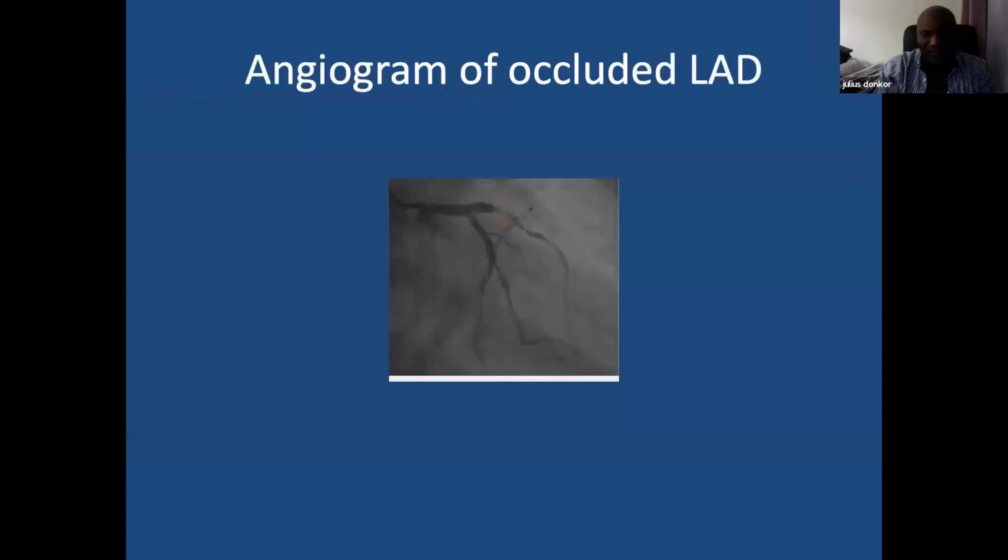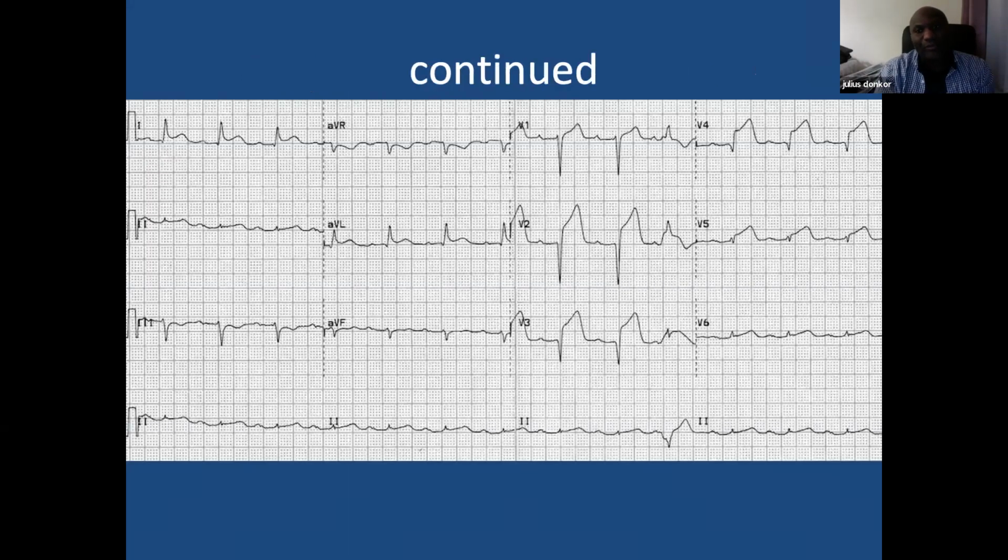So we went through an angiogram of an occluded artery. Anterior MI, we learned last week, is usually your proximal LAD. It could be your mid LAD as well. Anterolateral involves your LAD and your circumflex. I think Dr. Daffy sent me an ECG during the week that had an anterolateral occlusion on it.